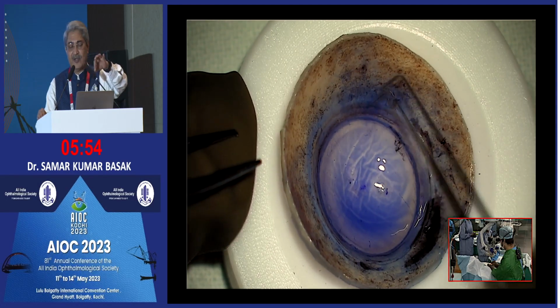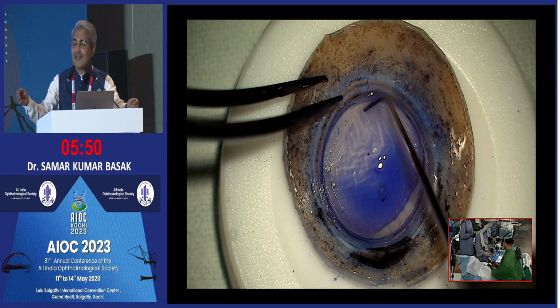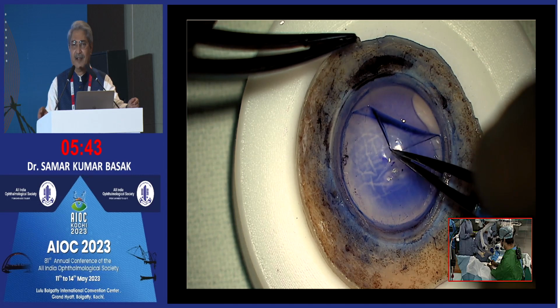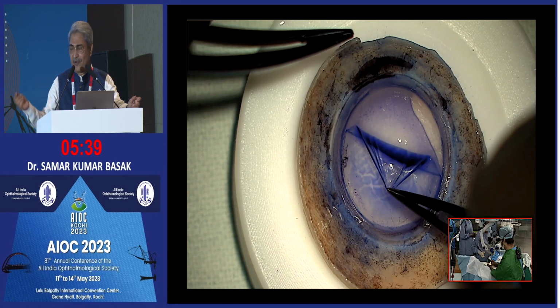This is the junior surgeon doing it, rotating it, and if you separate 360 degrees, I am telling you there will be no radial tear in any case. So we have shifted from McPherson to this; any hook or chopper can do this job.